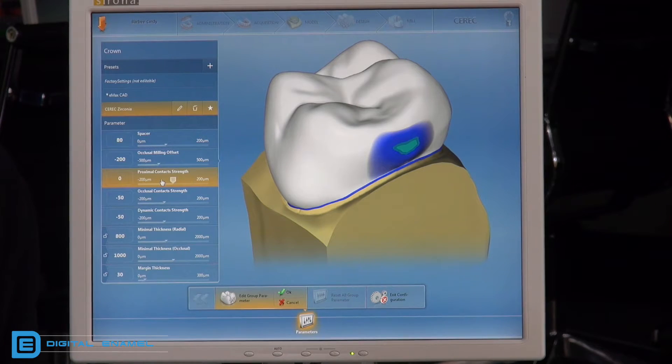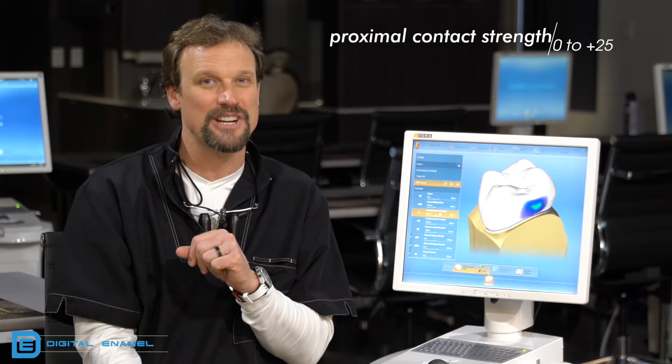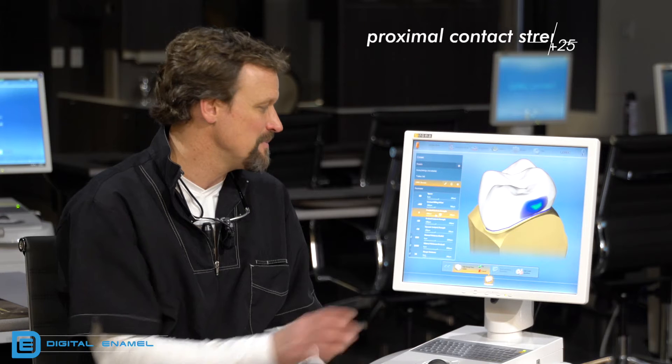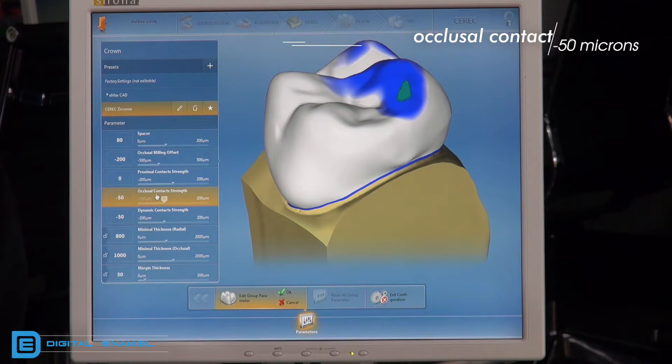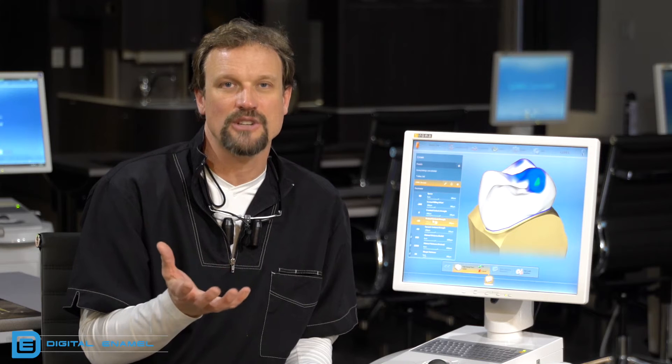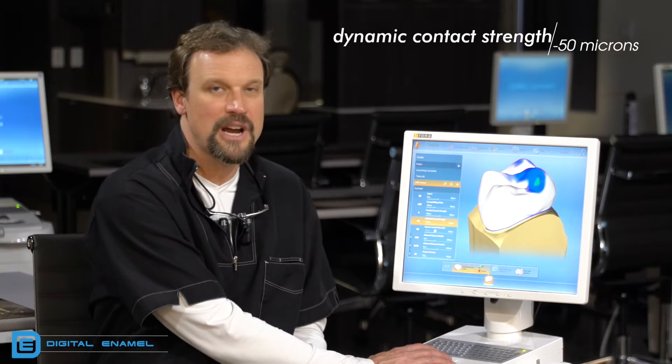For Serret zirconia crowns on the interproximal contact strength, you want just a very little hint of green — barely a little bit of green — and you'll get a really nice contact. For occlusal contact strength, set that at minus 50. Minus 50 allows the proposal to be slightly in infra-occlusion, which allows you to build up the occlusion slightly. Dynamic contact strength is also set at minus 50.